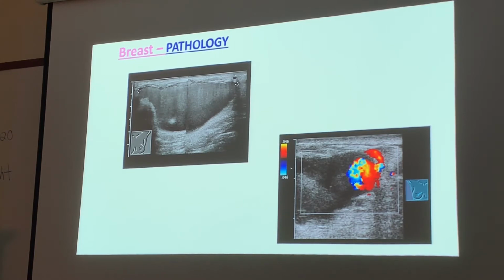Everybody knows where the body markers are on IU-22s or whatever machine you're using. On the Epic, get it? You know how to pull it up? It should be on the top right. It should be a button like on the top right. I think it's on the second row, the third from the left. Okay. So use those. Just like you see those body marks right there, you have another one right here.